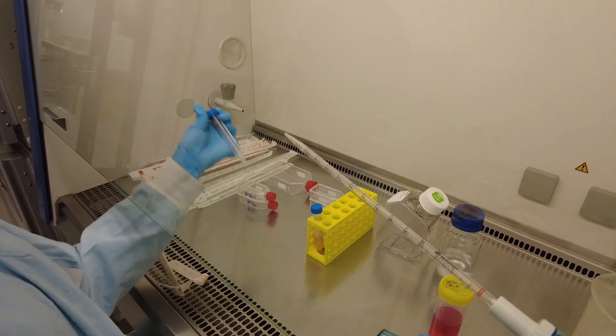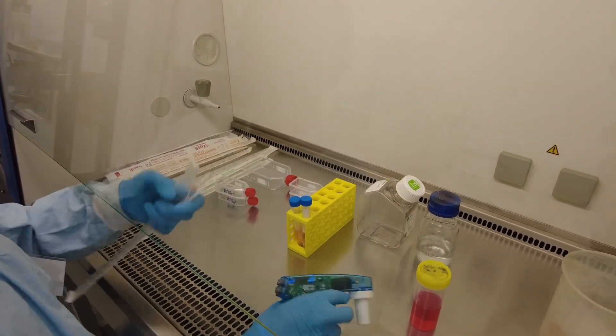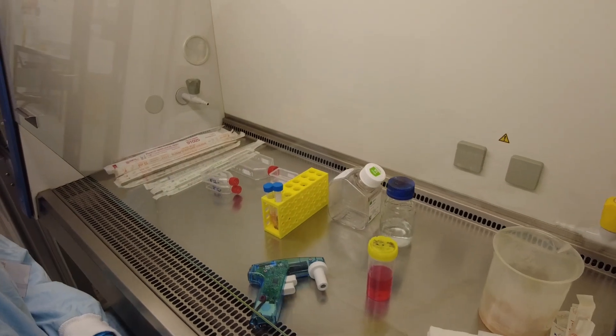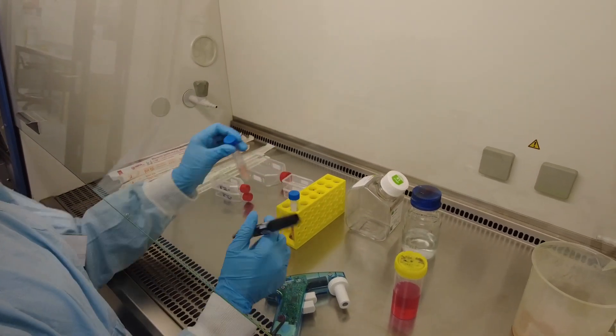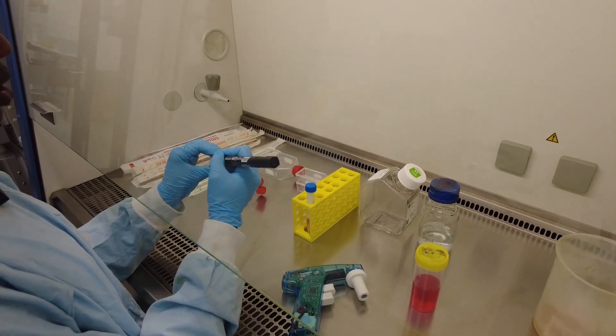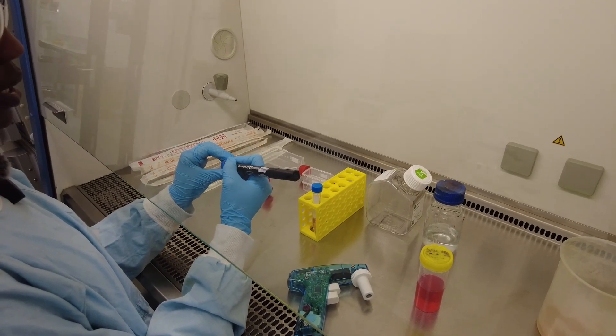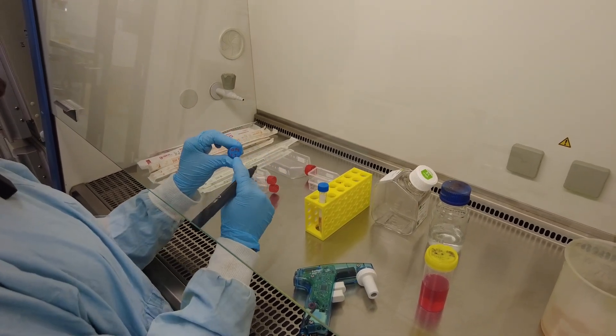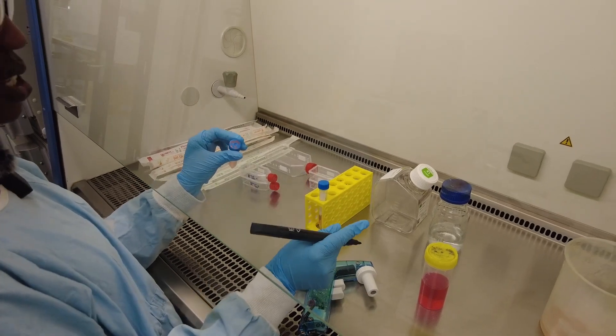We're going to label the tubes and centrifuge. So the name of these normal cells is CCD841 and they're Passage 2 which is the second time that we're splitting it and we're going to put it into Passage 3.